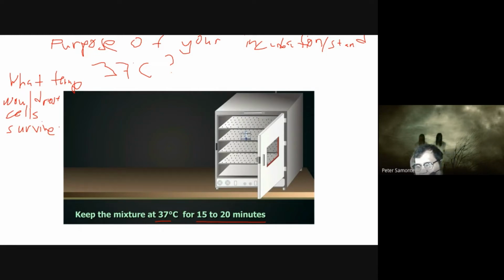Sige, class, kaya niyo yan. Why do you need to keep the cell alive? Okay. Tama naman si Miss Villarreal. Class, remember, you are using supravital stain. Now, if the cell is dead, the stain won't be absorbed.